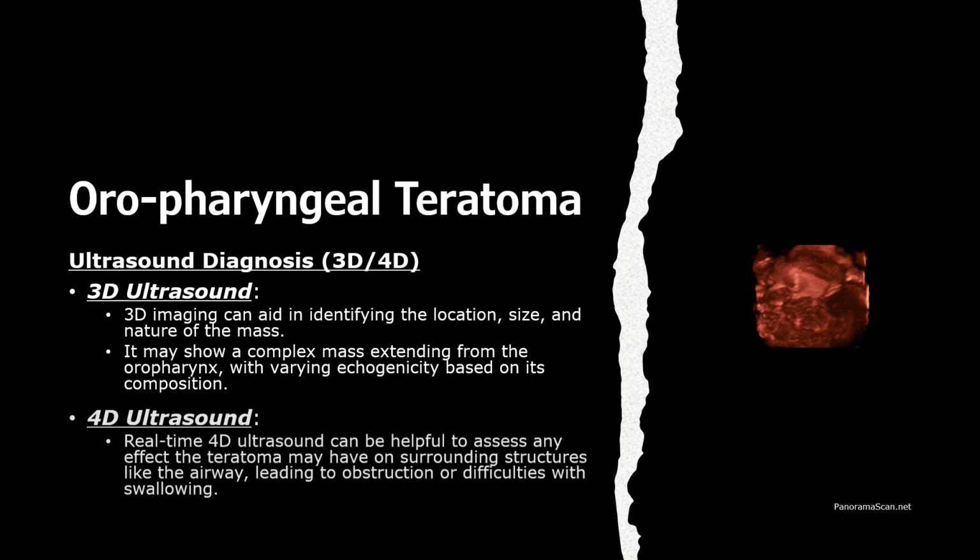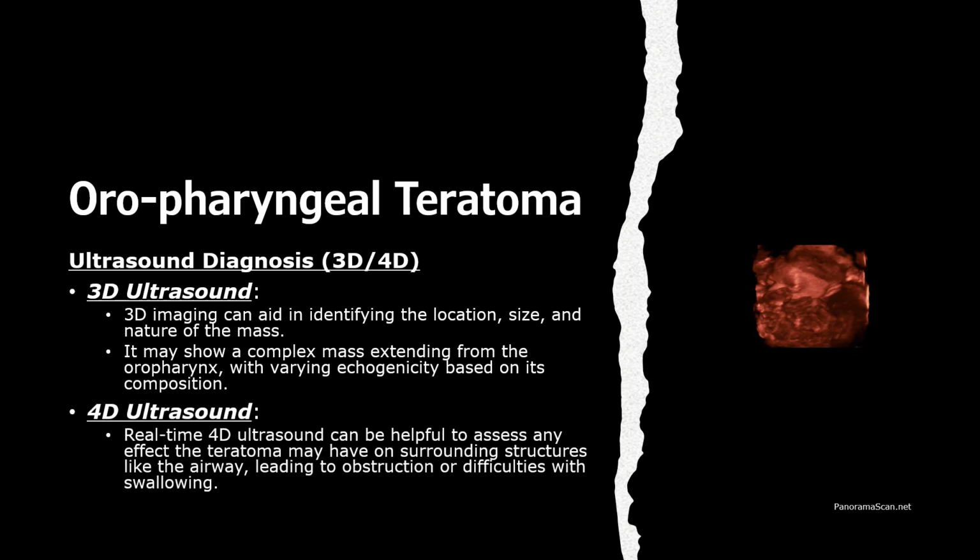While 4D ultrasound, on the other hand, offers a dynamic real-time perspective. This is particularly useful for assessing how the teratoma impacts surrounding structures, such as the fetal airway or esophagus.